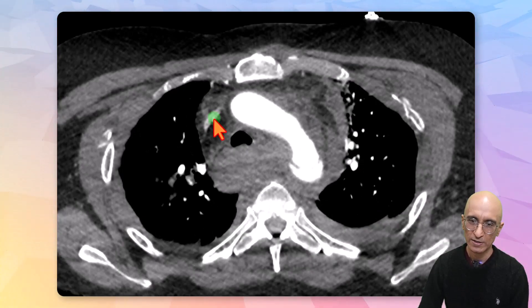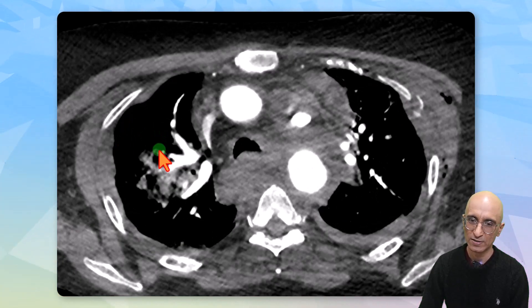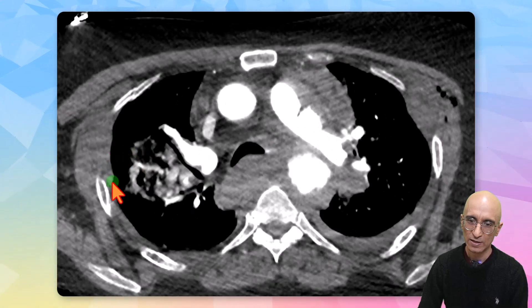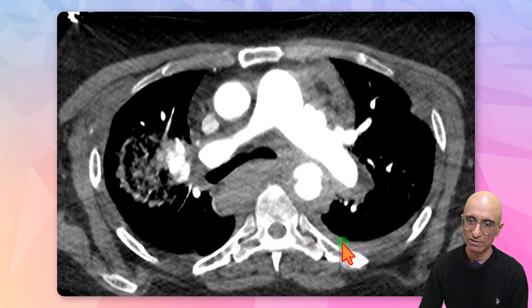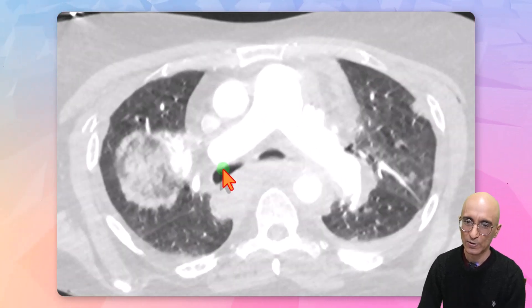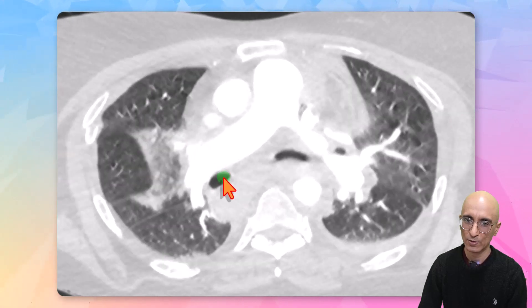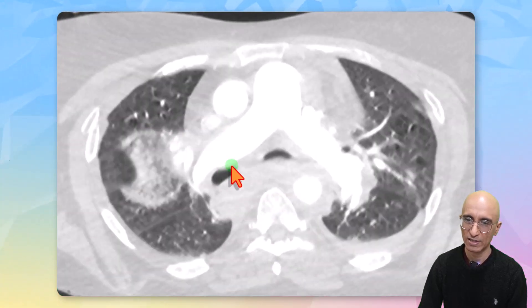As I scroll through the images, you can see the patient has bilateral rib fractures, hemothorax bilaterally, and on the lung windows you can see multiple foci of lung contusions bilaterally.